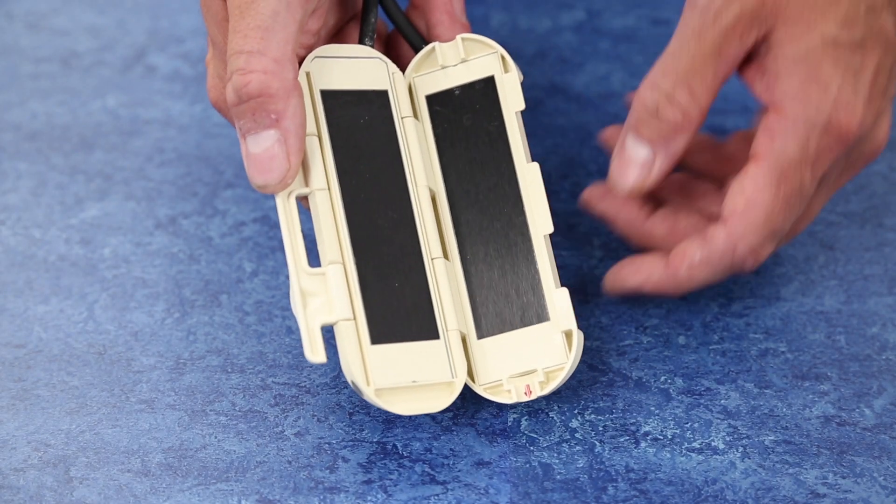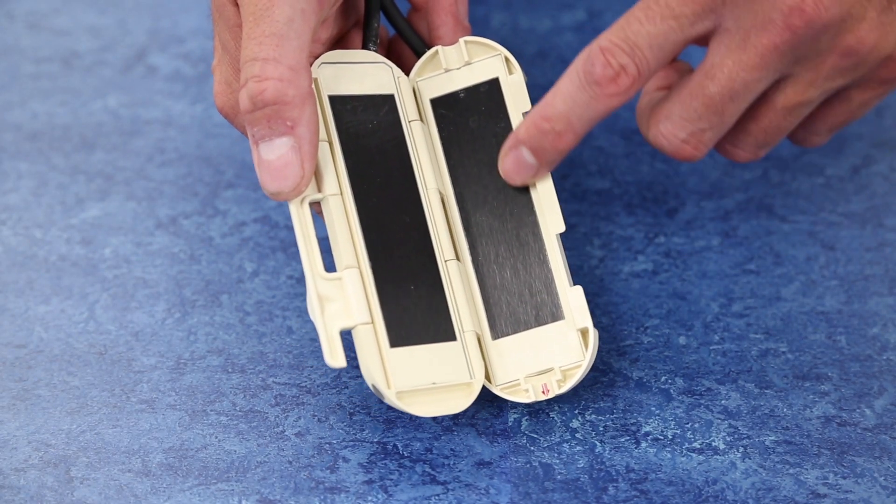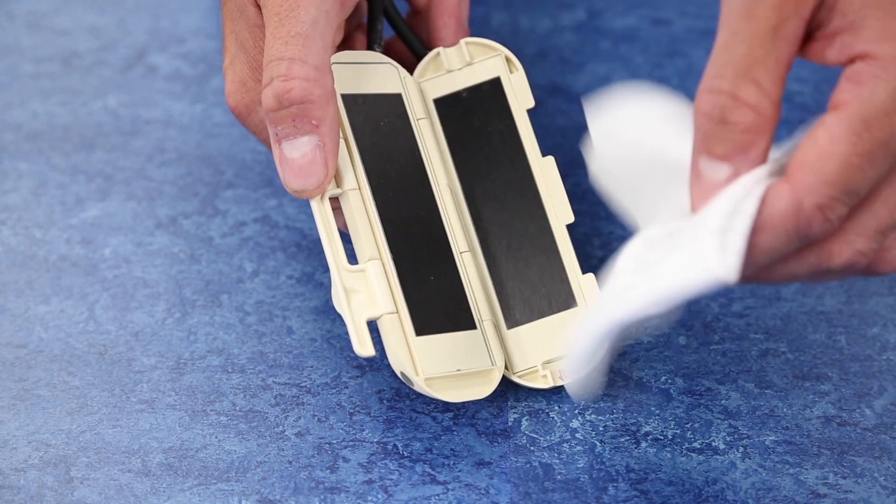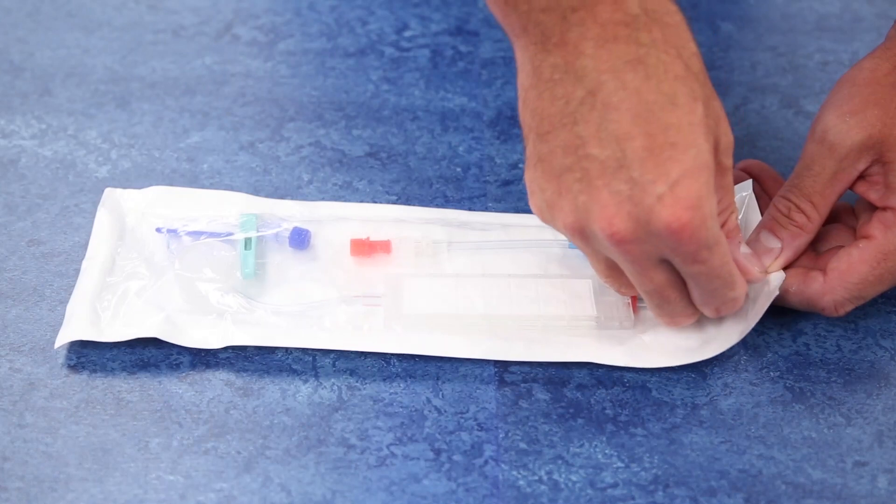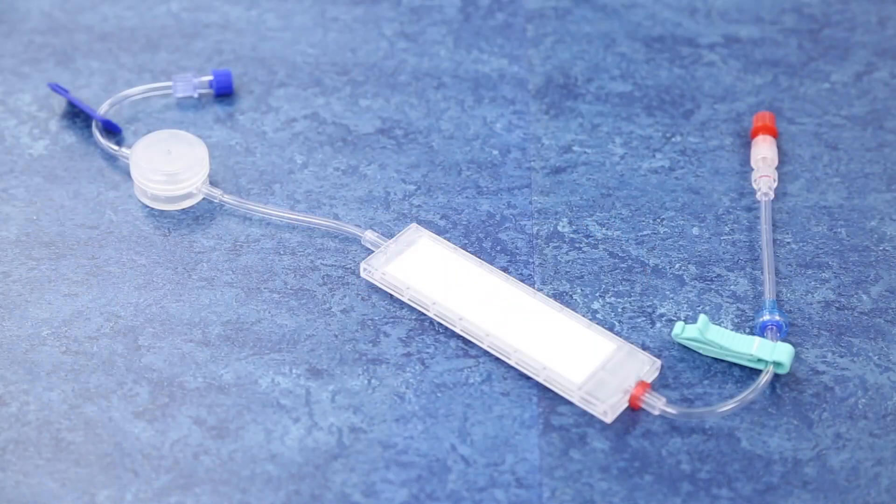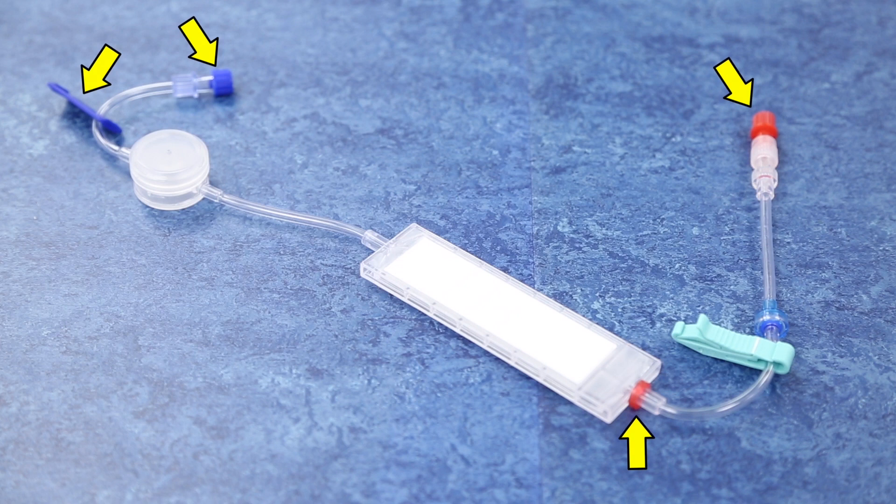Inspect the heater unit to ensure that the heater plates are clean and dry. Wipe off any particles or debris on the heater plates with a soft cloth. Carefully remove the disposable from its pouch. The disposable set is color-coded and keyed to ensure proper placement in the heater unit.